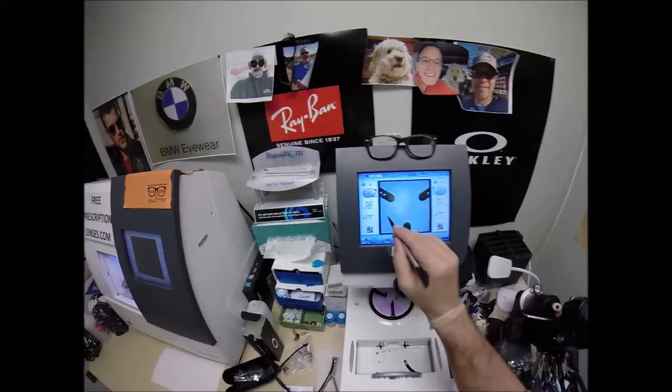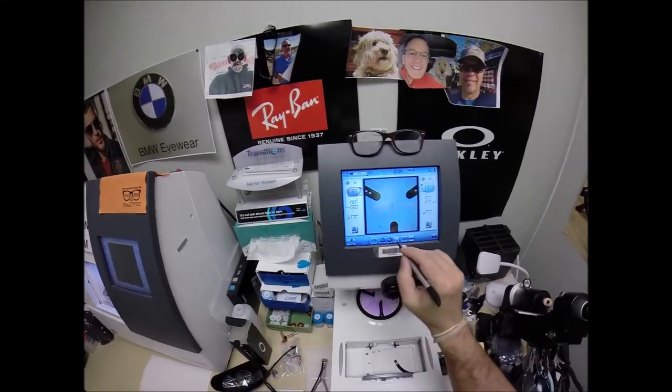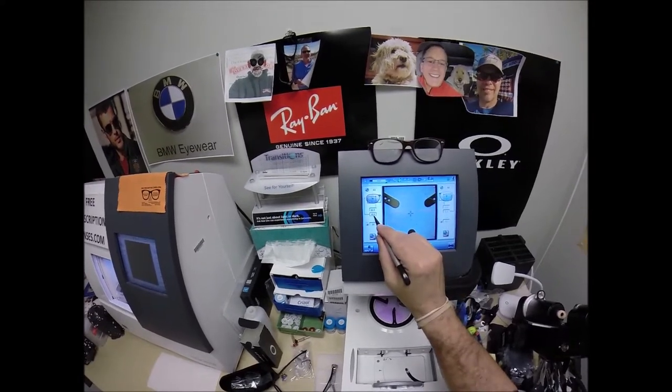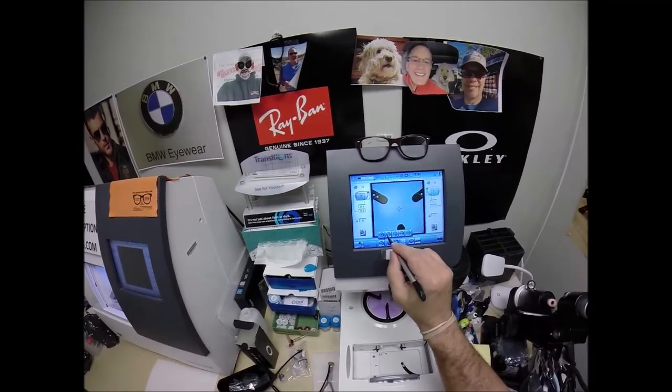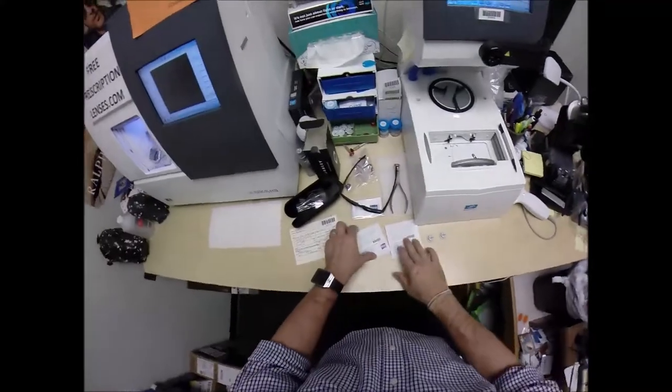Now that's the shape that we'll be cutting. I'm going to drop the pupillary distance down to 32, which is the pupillary distance for each eye. Raise the optical center height up to 19 for the position of wear. Change the layout screen to the progressive lens.